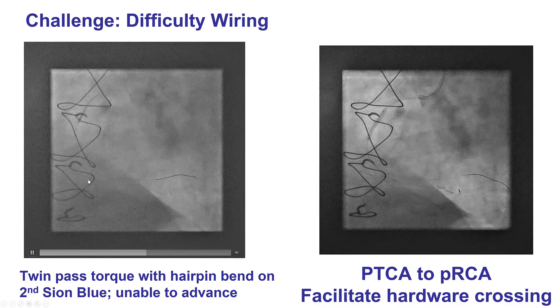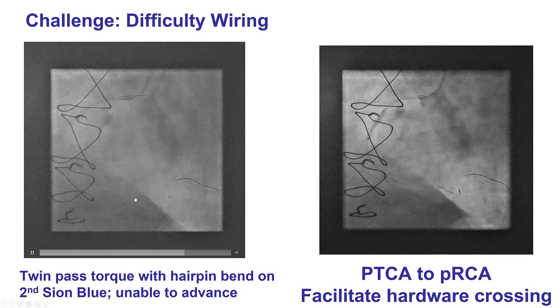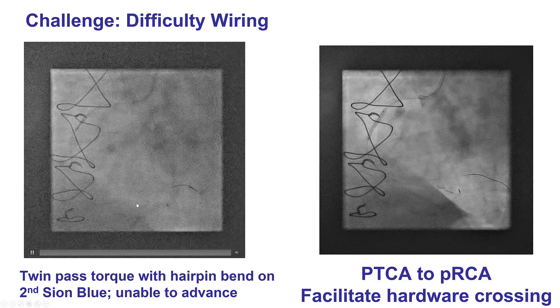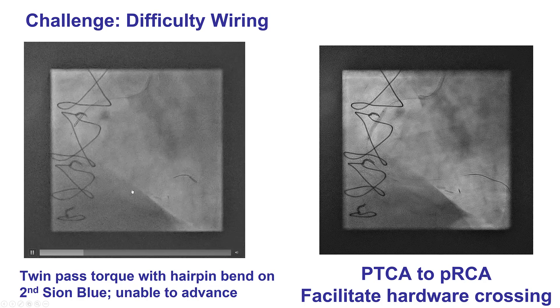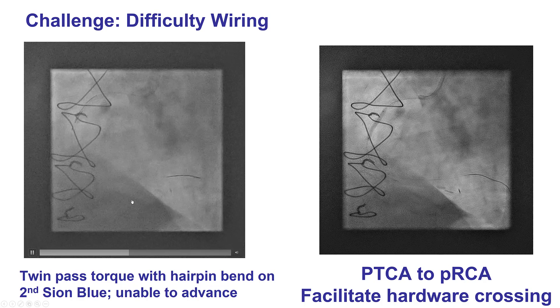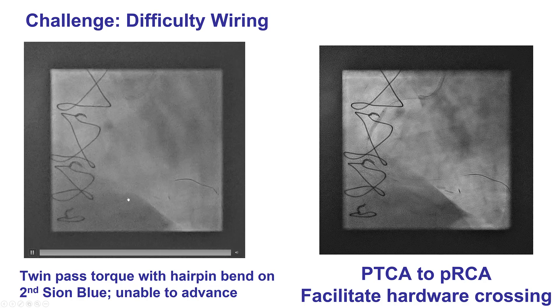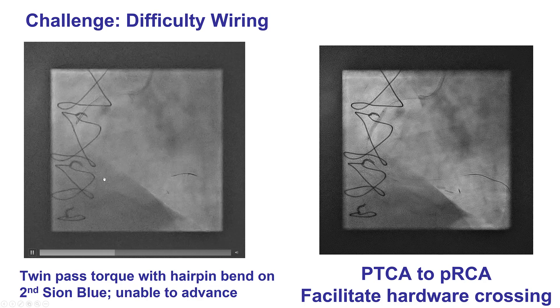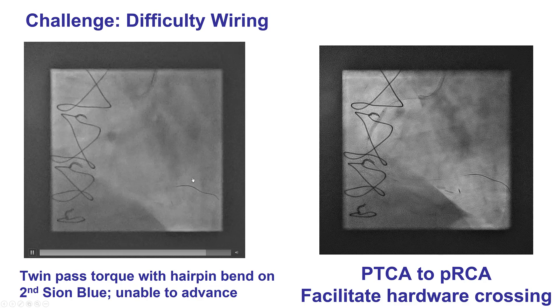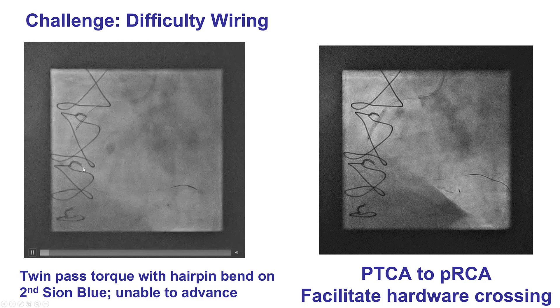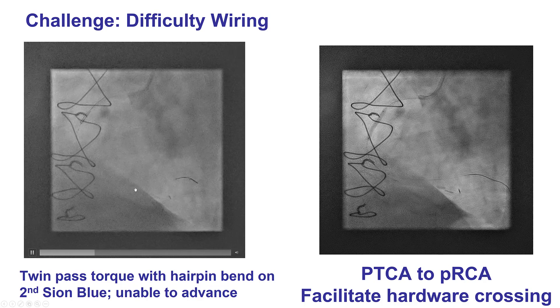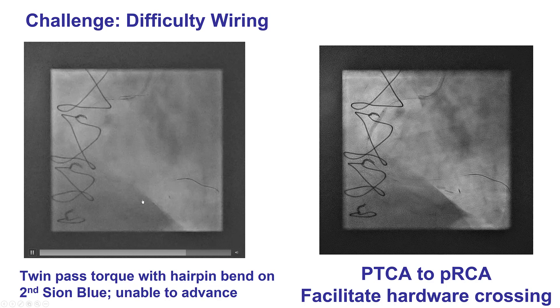However, it was quite challenging to get into the PDA because the vessel was tented, as we saw previously, from the saphenous vein graft. We advanced a guidewire into the posterior lateral, but then had a lot of difficulty getting a wire into the PDA.